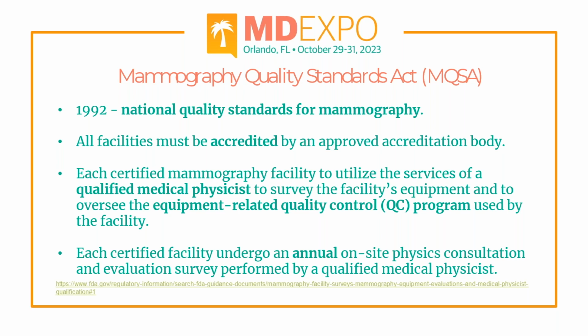It laid out certain requirements: you need to have a qualified medical physicist who surveys the facility's equipment, to oversee the equipment-related QC program used by the facility. They need to go through an annual on-site physics consultation and evaluation survey performed by a qualified medical physicist, and all the details are spelled out in this requirement.